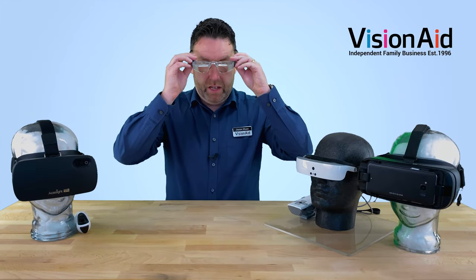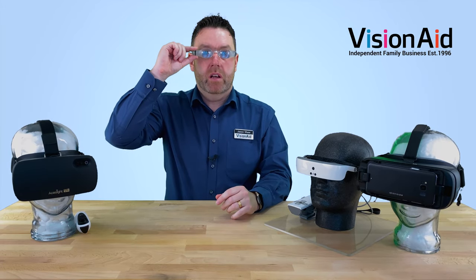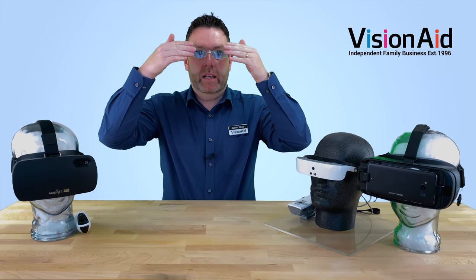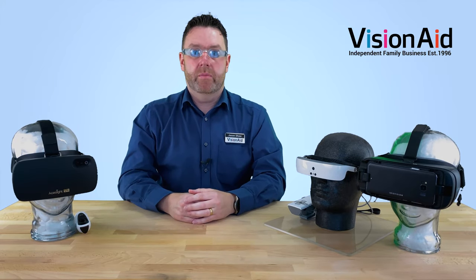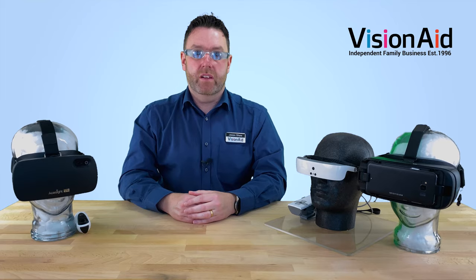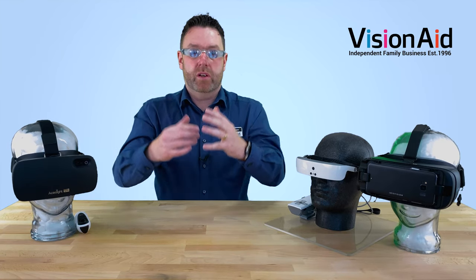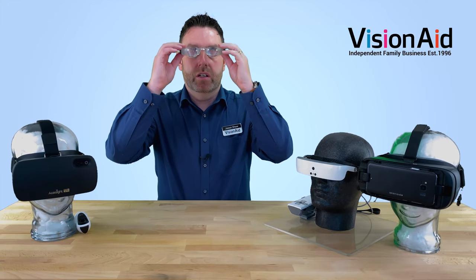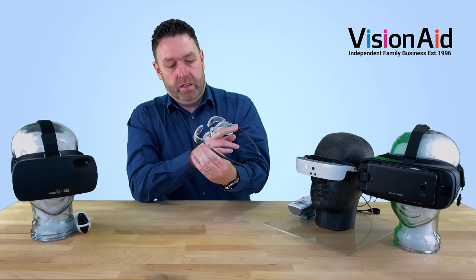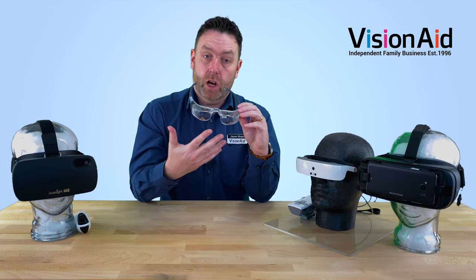You're not going to win any fashion awards when you've got them on. You put them on and adjust the lenses independently to get the best focus and then they'll magnify. There are two different versions of these that we sell. These are called the Max TV, so these are for distance work with 2.1x magnification — great for watching television. We also do ones called Max Detail which are for much closer work.